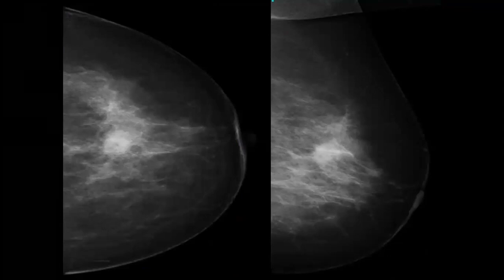We started late. This is the craniocaudal on the left side and the mediolateral. I think mediolateral oblique. Yes, it is a mediolateral oblique, you are right. And there is a focal asymmetry at the upper outer quadrant of the breast. Where again? Upper outer part of the breast. At the middle part of the breast. Is it outer? Yes, it is outer. This is the nipple. This is more or less central. Yes, this is upper central.